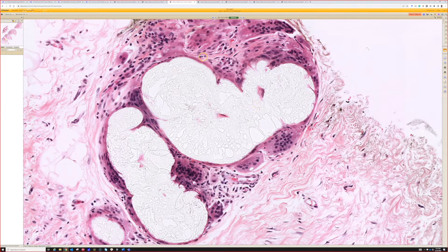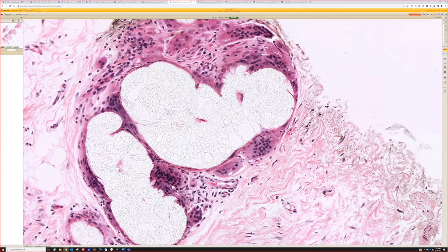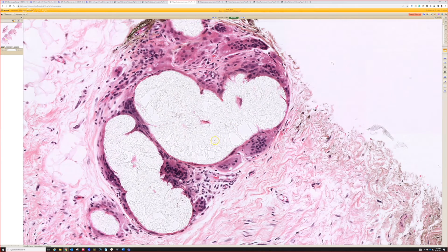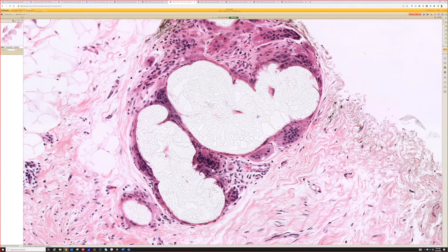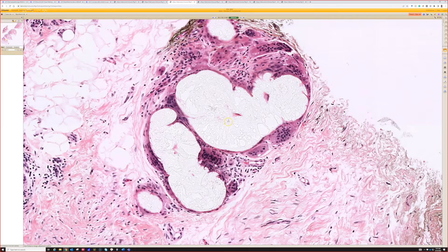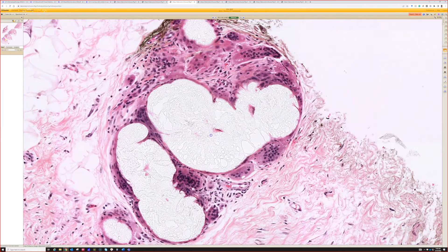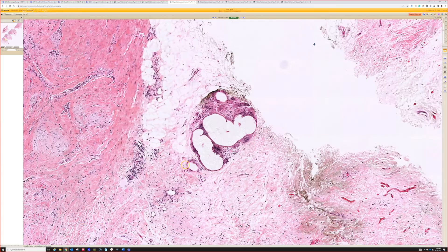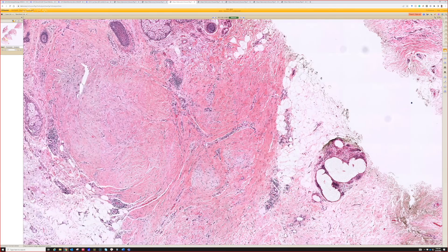Here it's kind of outside the scar. It does not always have a foreign body reaction around it — in fact, most of the time when I see it, it does not. I'm not exactly sure why, whether it's some additive that makes the foreign body giant cells react to it. But if you see this kind of frothy whitish-blue material, you can think that it might be steroid.